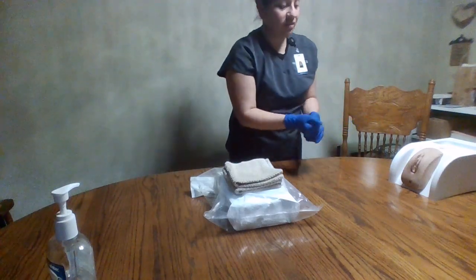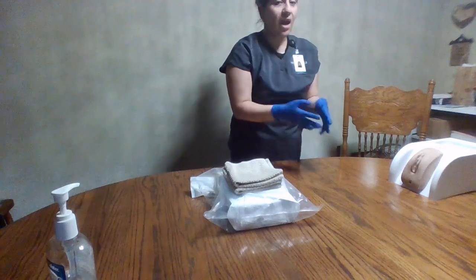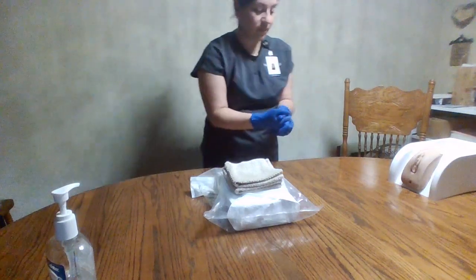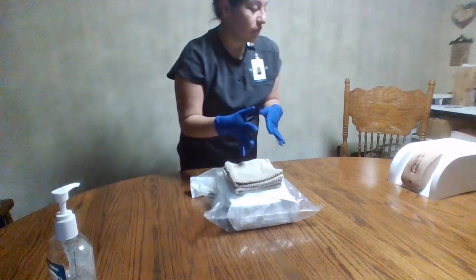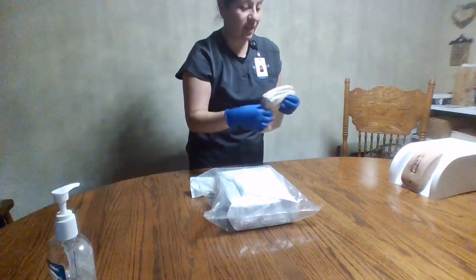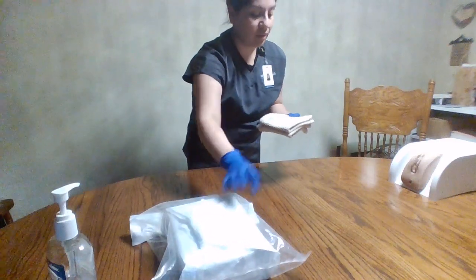Okay. And then if I could have you bend your knees and open, exposing the perineal area. I would also raise the bed, making sure that the patient is at a correct height. All right, Mrs. Smith. So looks like we have you in the correct position. I am going to begin the process of cleansing. Is it okay if I touch you? Okay, perfect. So we'll grab my items.